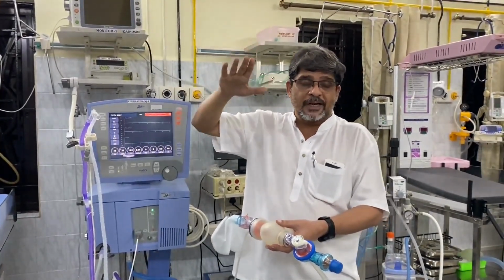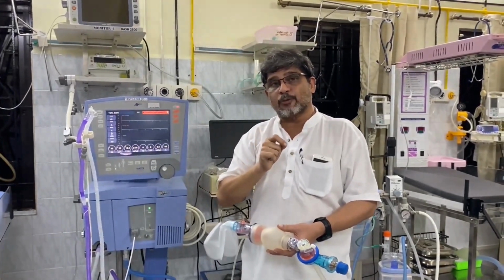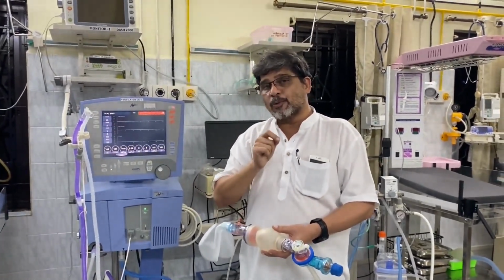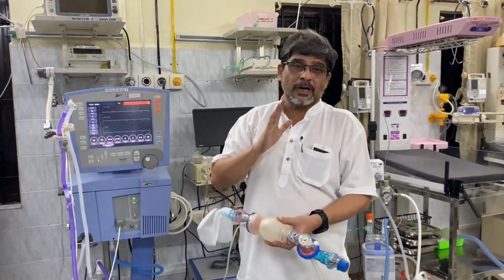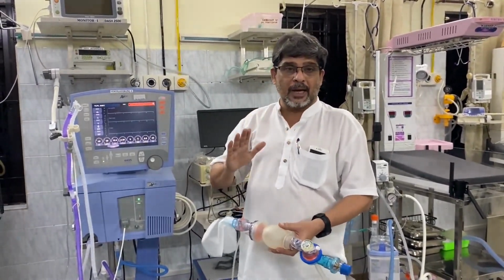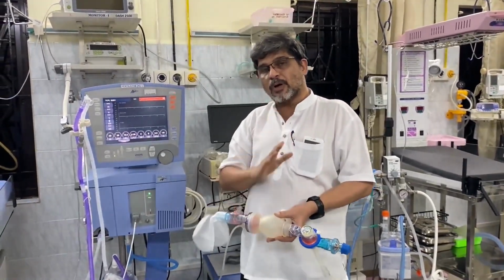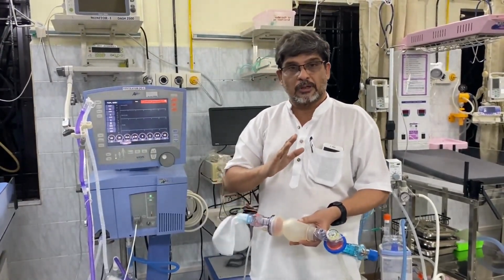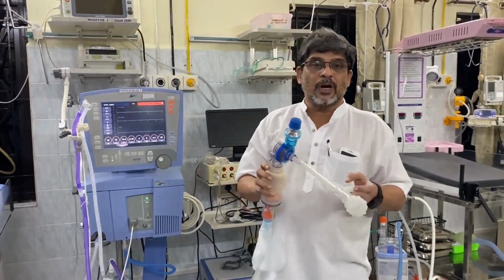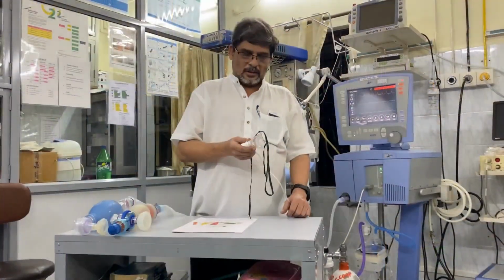Once the lungs are overinflated, cardiac output of the patient decreases because you are doing positive pressure ventilation, you are not doing negative pressure ventilation. Once the cardiac output decreases, the patient goes into shock. So you have to be very careful when you titrate your PEEP and PIP so that you do not cause mechanical trauma to the lungs, do not cause pneumothorax and do not cause decreased cardiac output. So this is nothing but an easy method of ventilation.